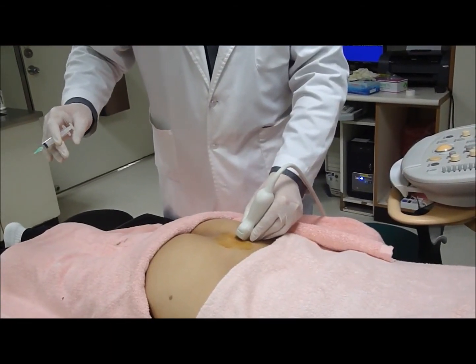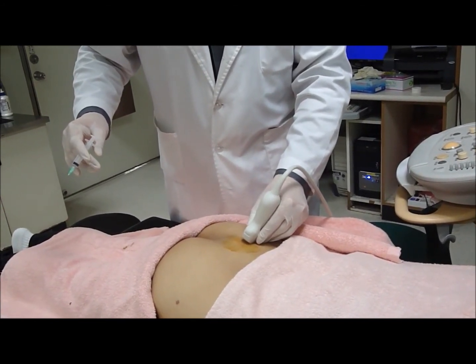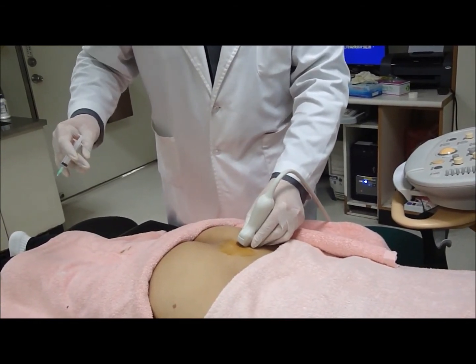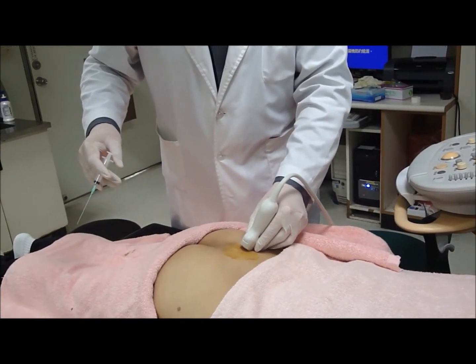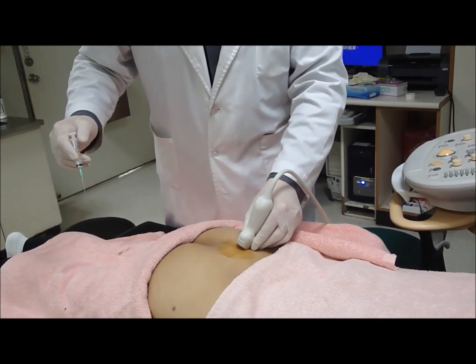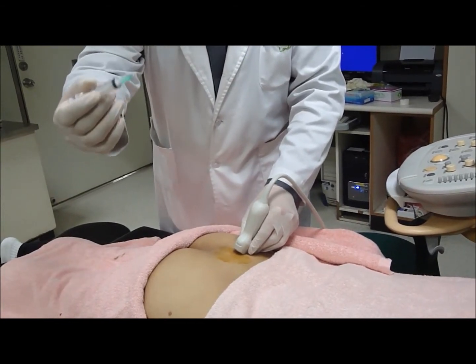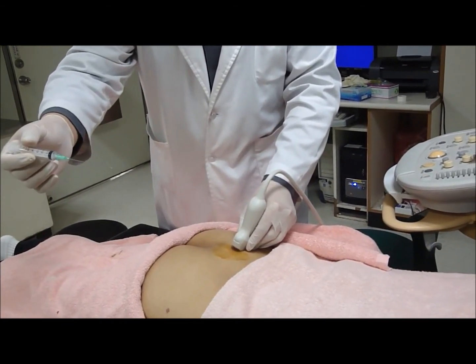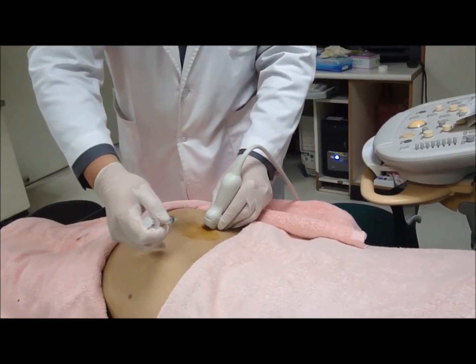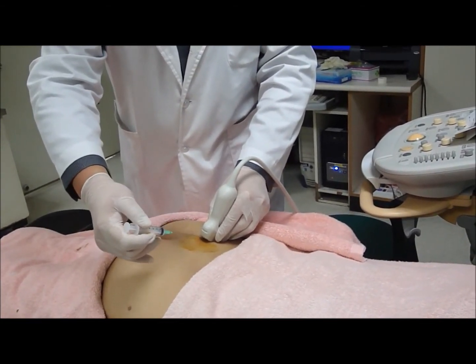We will now start our ultrasound guided sacroiliac joint injection to the left side. After we have identified the exact location of the sacroiliac joint, we can now start our injection procedure. During the injection, the needle is approached from medial to lateral — that is, a medial to lateral approach.